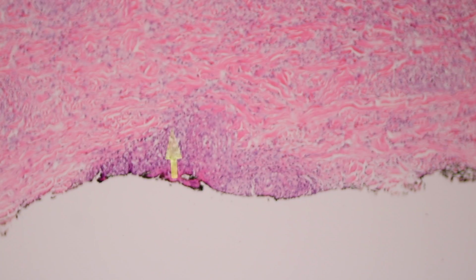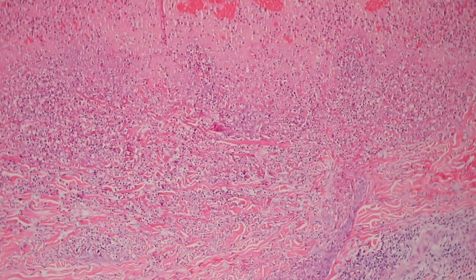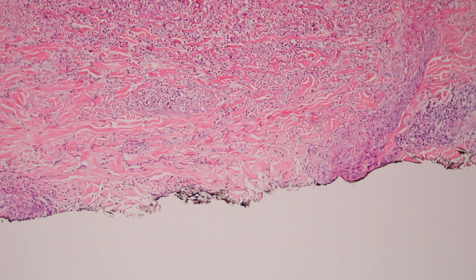So when there's deep involvement, we think of systemic vasculitis as a possibility. When you see a bunch of EOs, you also think about systemic involvement. And when you see a lot of neutrophils out away from the vessel, the individual vessels, those can be signs also that you're dealing with a systemic process. Now, let's show a couple of other unusual variations on vasculitis here.